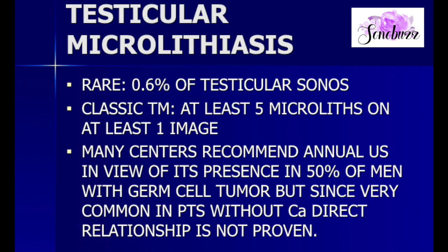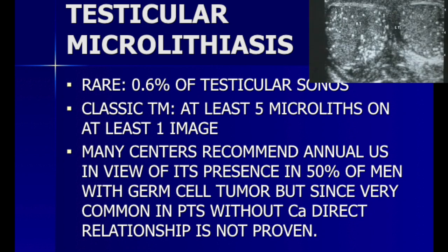It is rare, 0.6% of testicular sonos, that is on all testicular ultrasounds. Classic testicular microlithiasis is defined when you see at least 5 microliths, that is at least 5 of those specular echoes on at least one image. Many centers recommend annual ultrasound in view of its presence in 50% of men with germ cell tumor, but since it's very common in patients without cancer, this direct relationship is not actually proven.